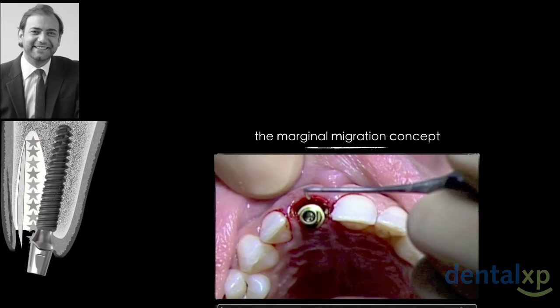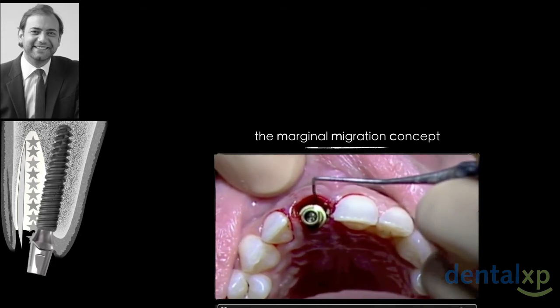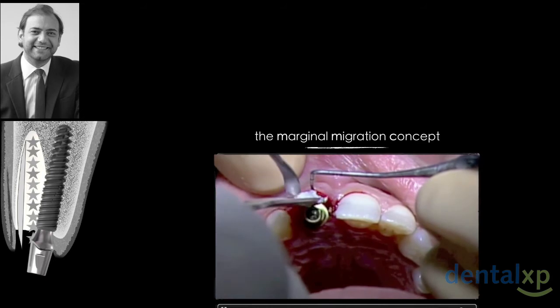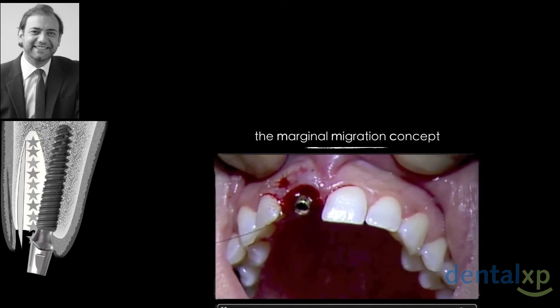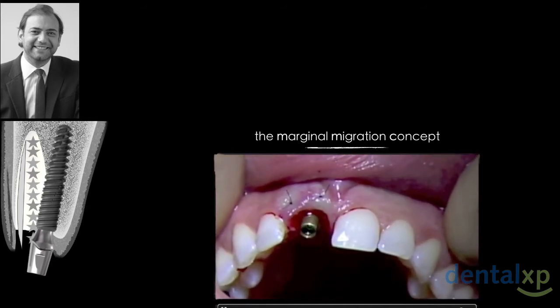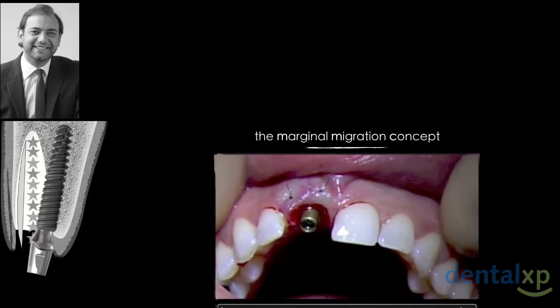And we will see this is very important to do. So after we do so, our assistant will hold the membrane in place and we will graft with a slow resorbable material, as you see here. After doing so, we will place two positioning mattress sutures, a little bit more centered and more apical, 1 to 2 millimeters to our margin.